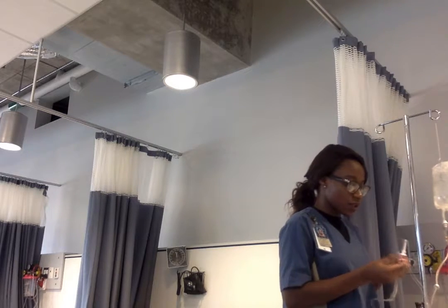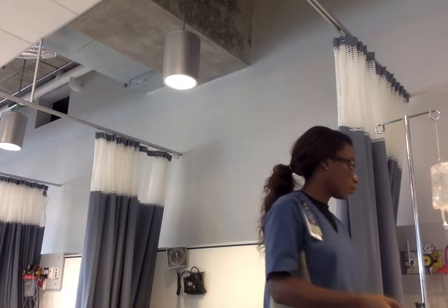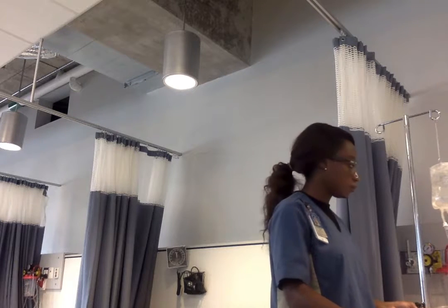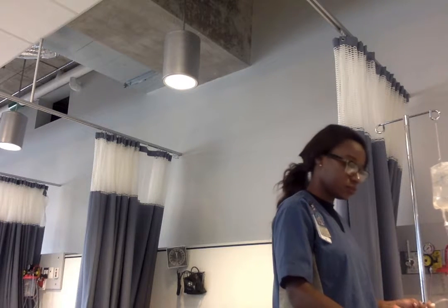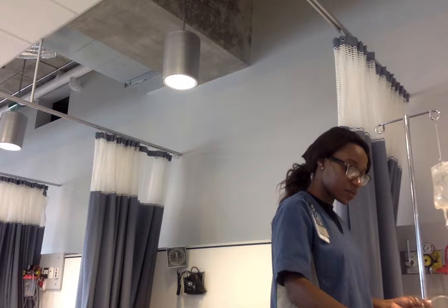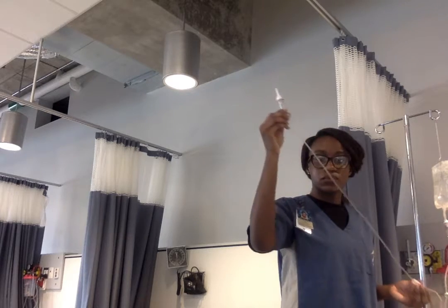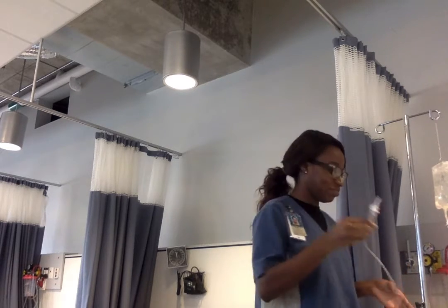Make sure that it's locked. Move the tip. I'm just going to prime my secondary line with the normal saline, and I'm just getting rid of any air bubbles. There's no air bubbles.